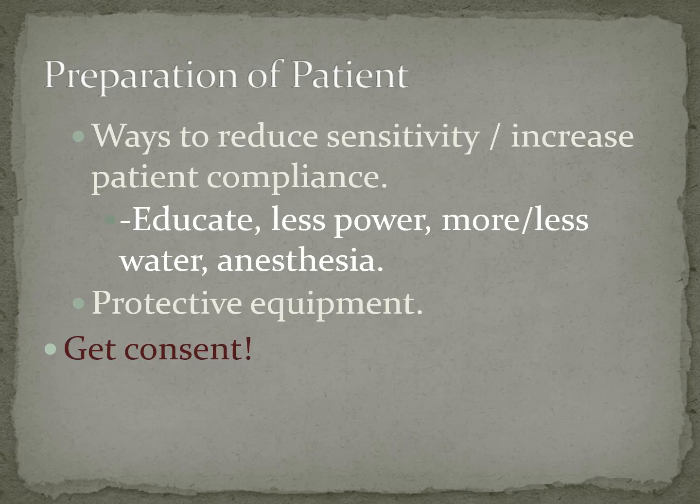So ways to reduce sensitivity. I said, educate them. Tell them what's going to happen before it happens. If they don't like the noise, maybe they can bring some earphones. If they don't like the water, let them hold the saliva ejector. Sit them up a little bit so it doesn't go to the back. Maybe turn the water and the power down a little bit if possible. Or we may need to get them numb. And always make sure it's on your treatment plan and you get consent to use it.